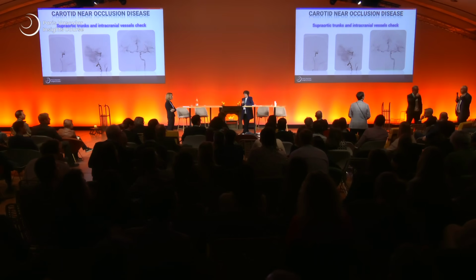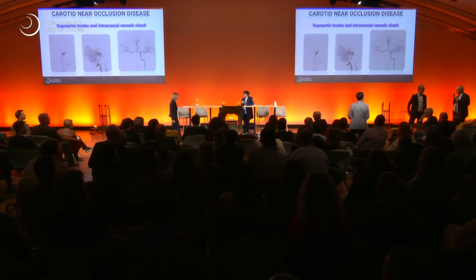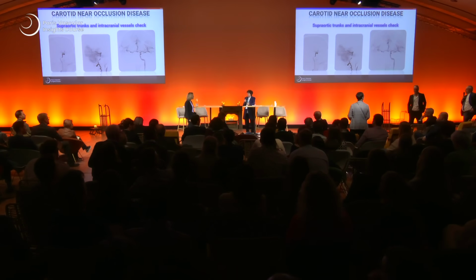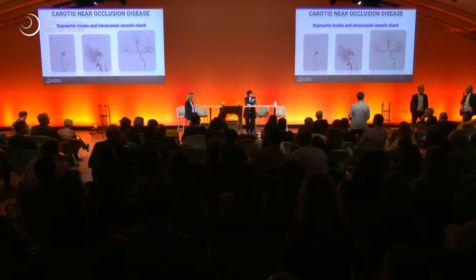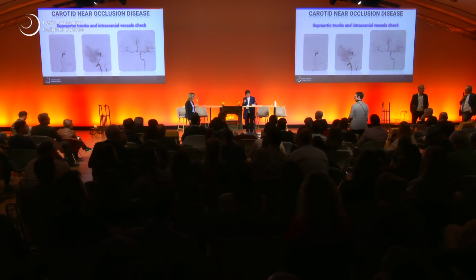You know, it's always better to have two carotids open than one carotid. Exactly. So if I get a perfusion scan that shows hypoperfusion of the right hemisphere, I go for proximal protected carotid artery stenting with flow reversal. May I ask you what kind of stent?